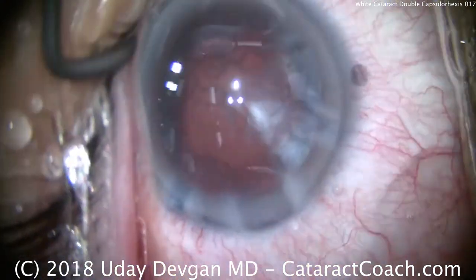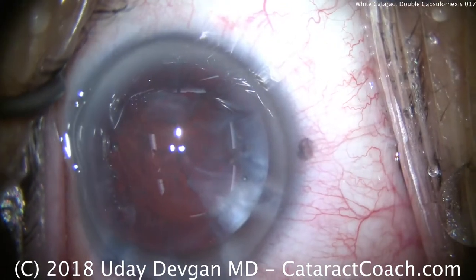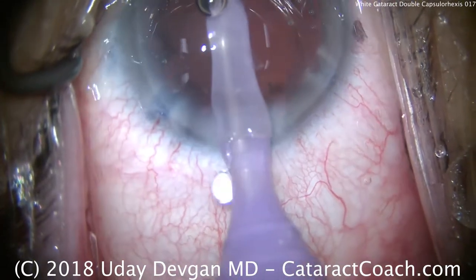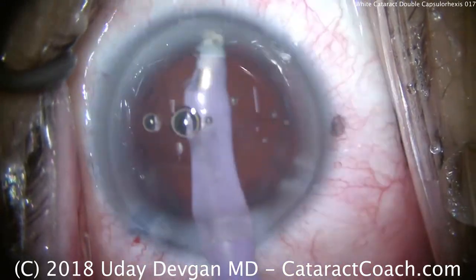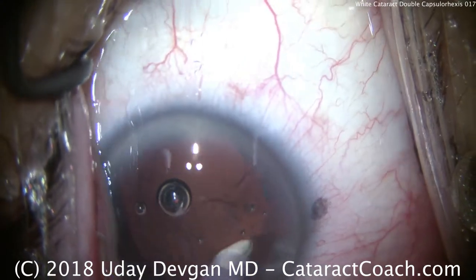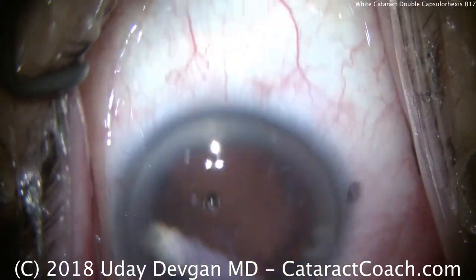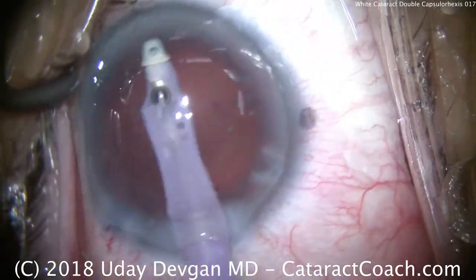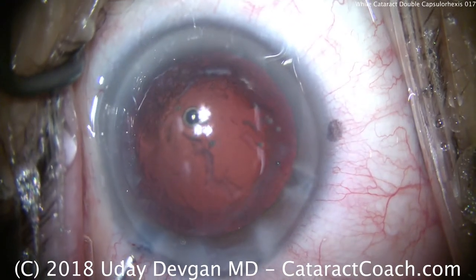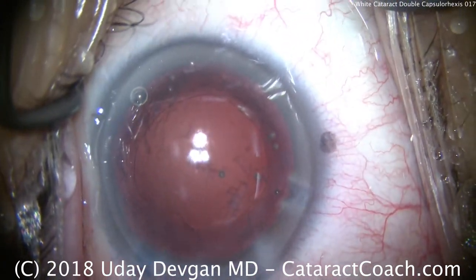So let's clean up the capsular bag and remove that cortex with the IA probe. It's important to remember that sometimes these white cataract patients have some scarring of the capsular bag, and you may not be able to remove all the little opacities that you see. Keep in mind that we use special lighting to highlight the red reflex, especially for these videos, and that can exacerbate the appearance of any capsular opacities. That looks great. So keep this technique in mind — the double capsulorhexis. It's very useful, especially if you don't have access to a half-million-dollar femtosecond laser. You can certainly use a simple cystotome or bent needle to accomplish a very similar margin of safety.